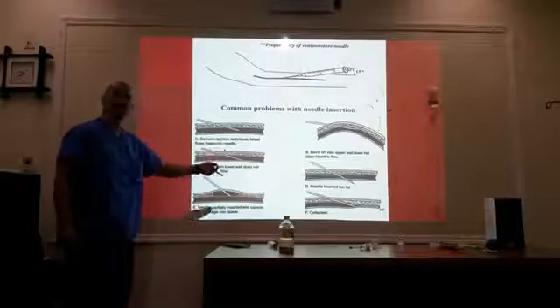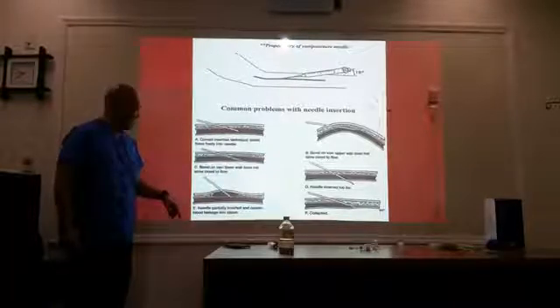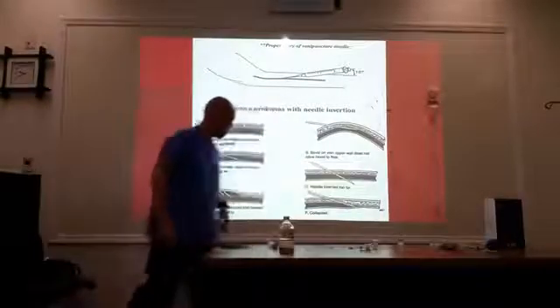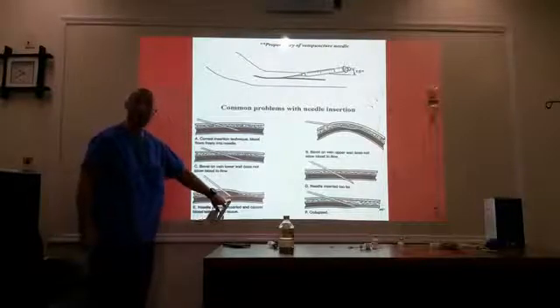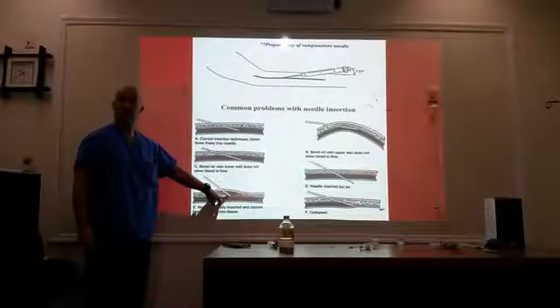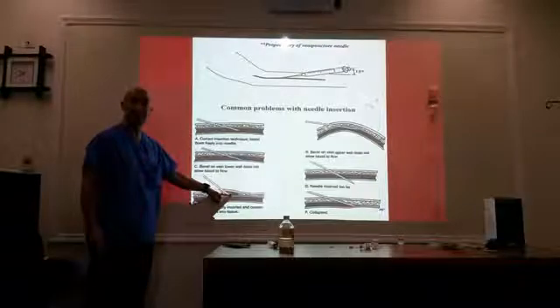If the bevel was facing down, now you're on the bottom wall of the vessel. D. This is what happens when you go too far. E. This is where we're talking about infiltrate, where the bevel is halfway in the vessel and some of it is sticking out. So when you inject the contrast, some of it may be going into the vessel, but it's also going into the surrounding tissue.